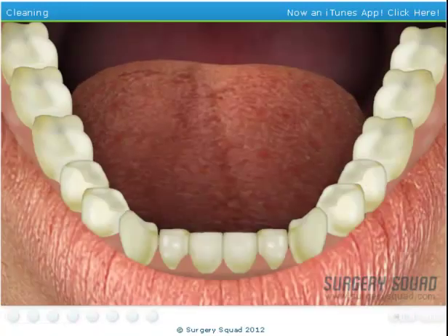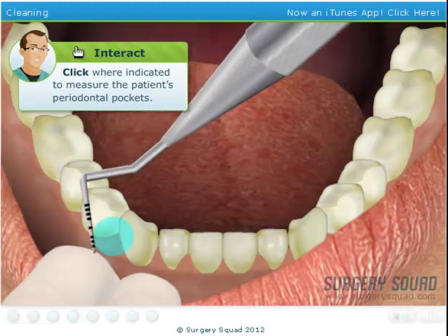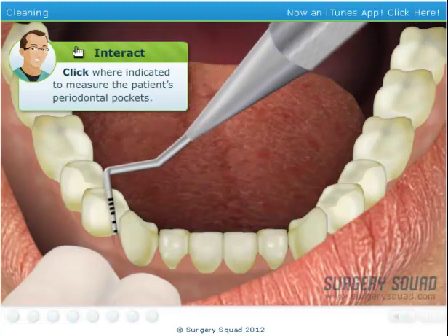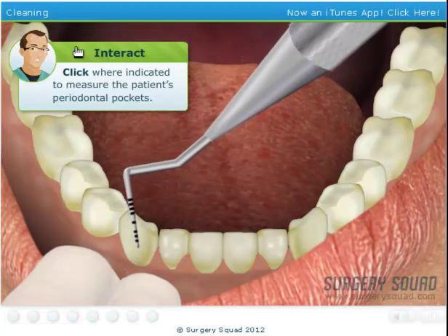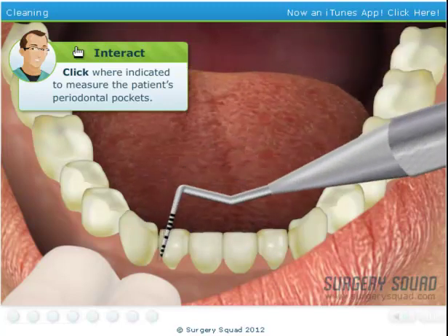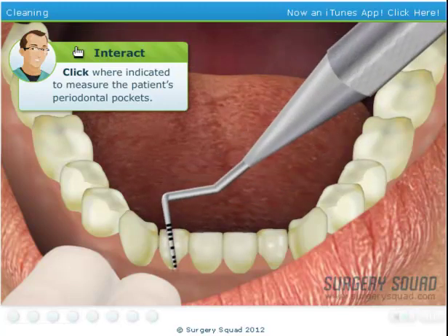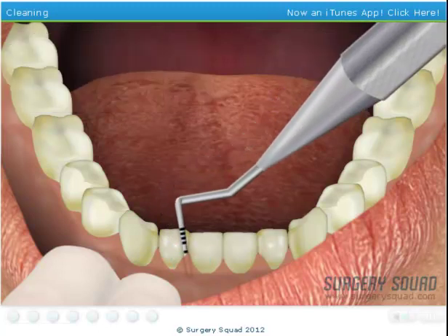Why don't you go ahead and use the probe to measure the depth of our patient's periodontal pockets? As you probe, I'll call out the measurements: 3, 1, 2, 2, 1, 4.